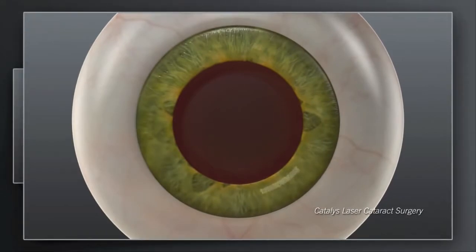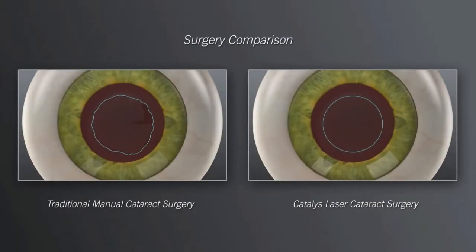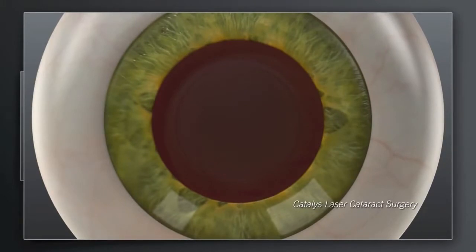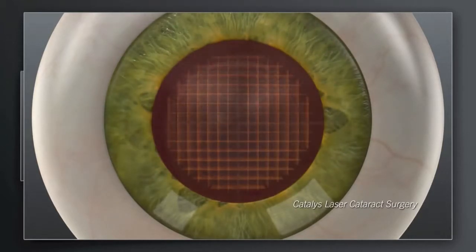With Catalyst, your surgeon can use the laser to make the corneal incisions with exceptional precision. Moreover, your surgeon can create the circular opening with the exact intended size, shape, and location using the precision of the laser. With Catalyst, your surgeon can also use the laser to soften the hard cataract and segment it into manageable pieces before ever entering inside the eye with instruments.